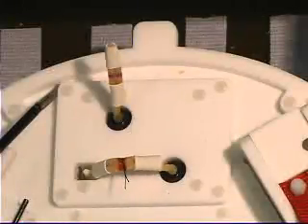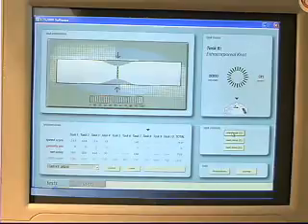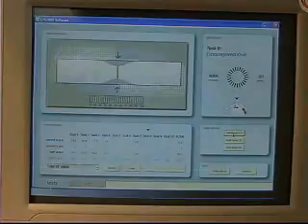The task is considered complete if the tension within the tube is maintained for a total of 3 seconds. 50 points are assigned to a knot placed outside of the target area, and a score of 0 is assigned if the 3 seconds of tension are not maintained or if the knot slips.